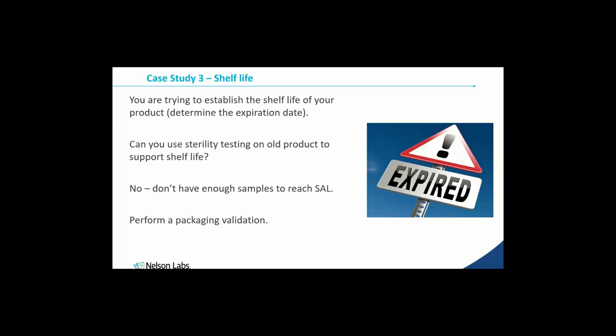And I think that speaks to some of the sterility testing so far. Let's consider that I've demonstrated and validated my product sterile. It's not going to just become unsterile. An organism's not going to come into existence. As one of my associates, a bit bluntly, points out, we've disproved spontaneous generation.